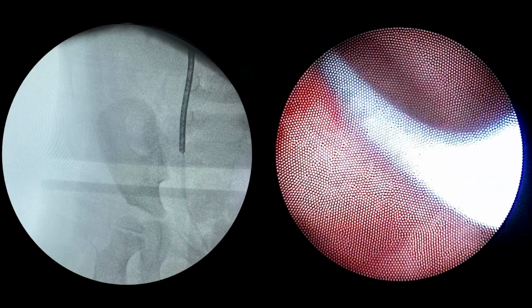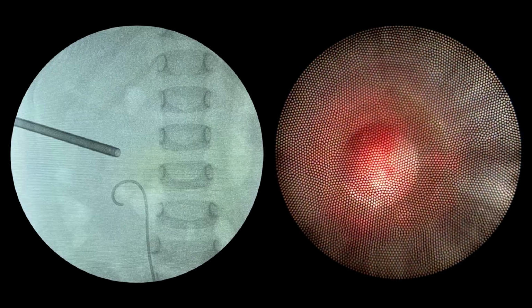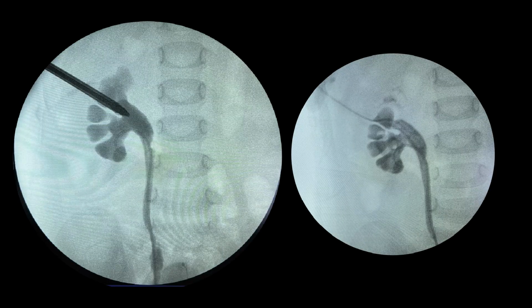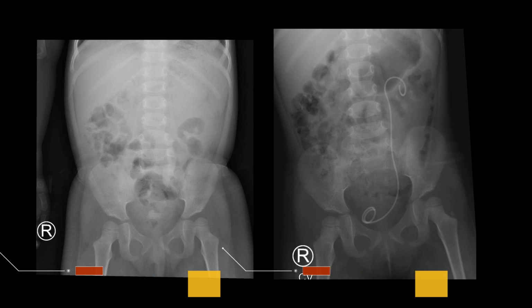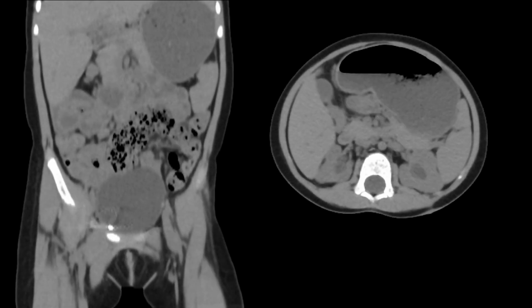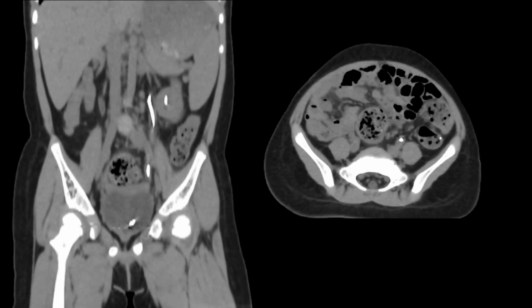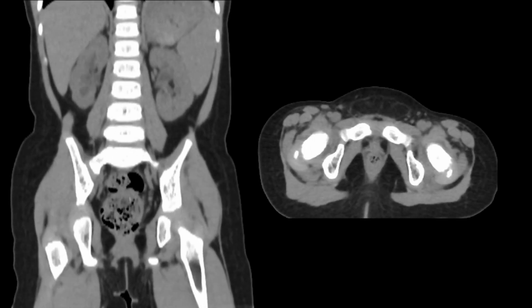Antegrade flexible ureteroscopy and final nephroscopy was done to check for residual stone fragments. A 4.7 by 16 cm DJ stent and nephrostomy tube were inserted. The patient's hospital stay was unremarkable, and she was eventually discharged. Patient was prescribed potassium citrate and hydrochlorothiazide by her pediatric nephrologist and advised to increase oral fluid intake. 5 weeks postoperatively, a non-contrast computed tomography was requested, confirming that the patient was stone-free. The patient then underwent cystoscopy, DJ stent removal.